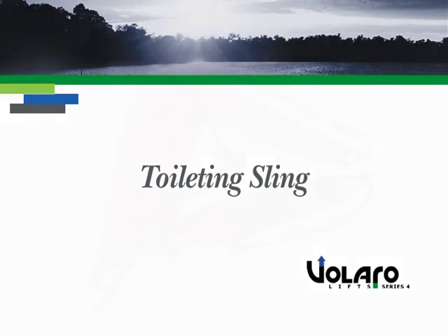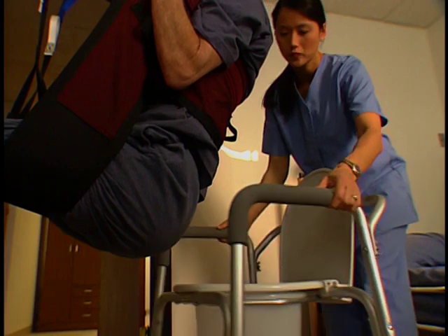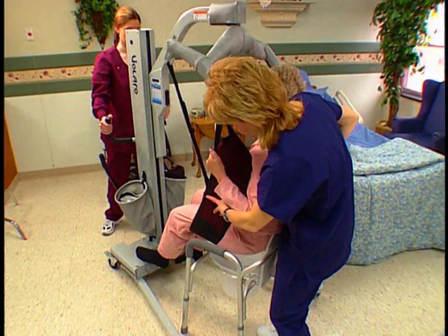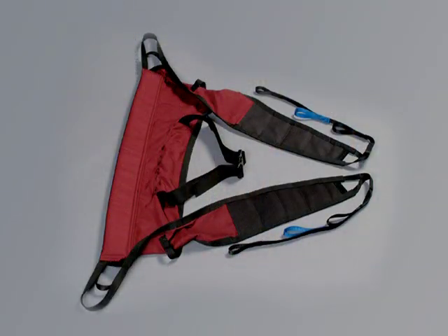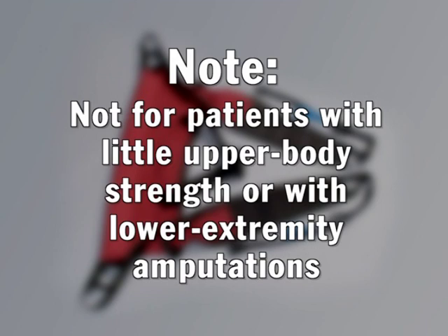Toileting sling. The toileting sling is available for patients with adequate upper body strength, but who may not have adequate lower body strength. It aids a caregiver in removing a patient's pants with little effort. It also makes pericare much easier. This sling comes standard with a built-in safety strap to be placed around the patient's upper abdominal area. Note: the toileting sling is not intended for patients with little upper body strength or with lower extremity amputations.